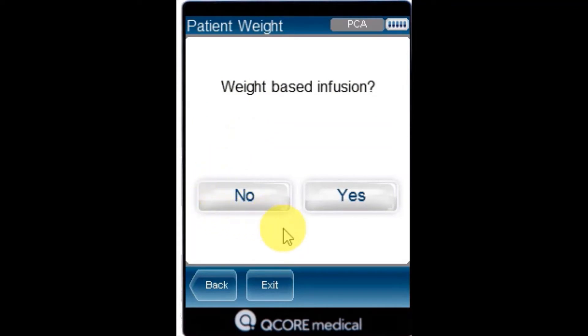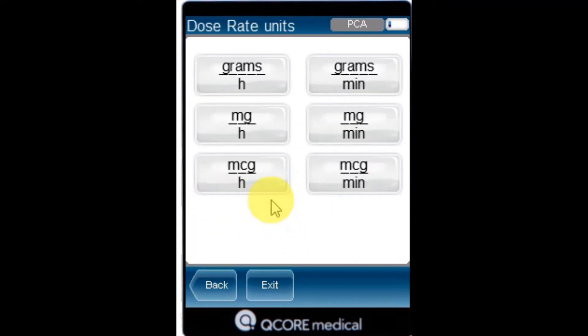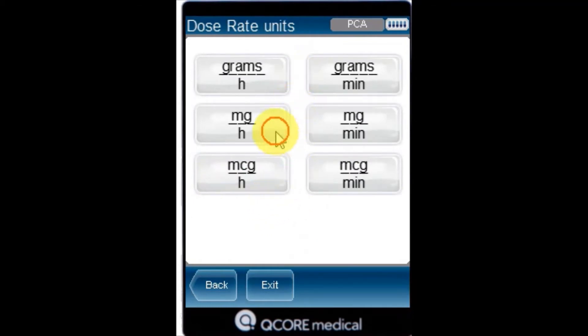If not using a weight-based infusion, press No. From the dose rate unit screen, select the appropriate dose rate units.